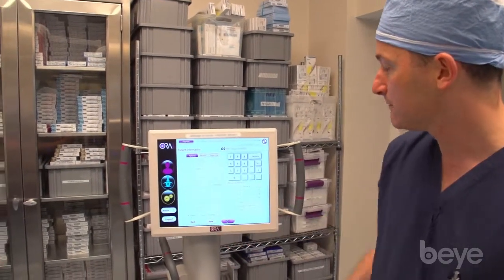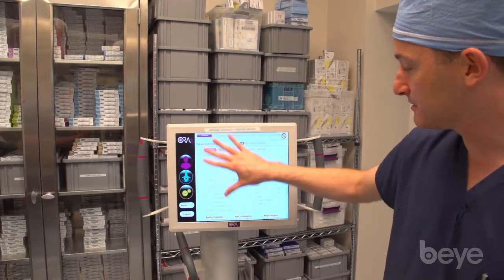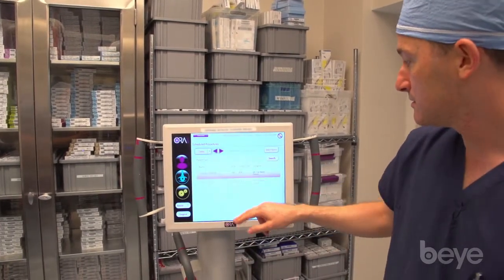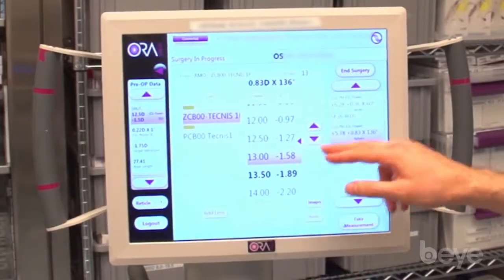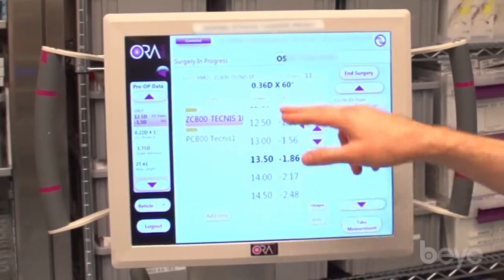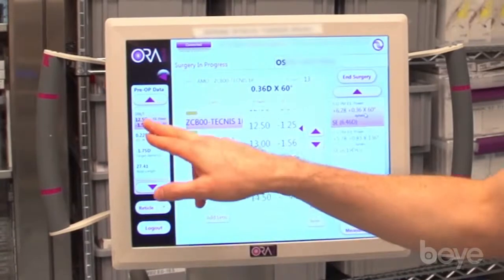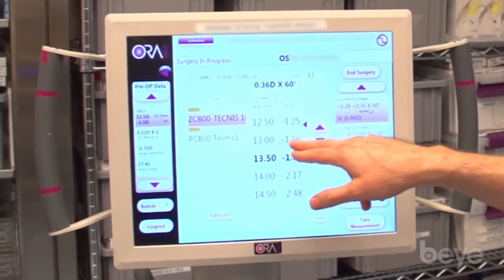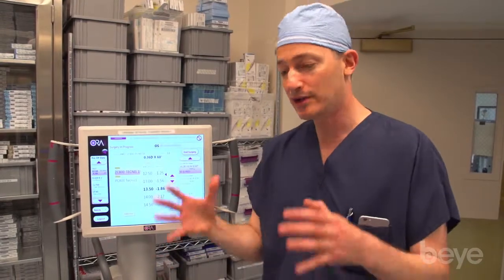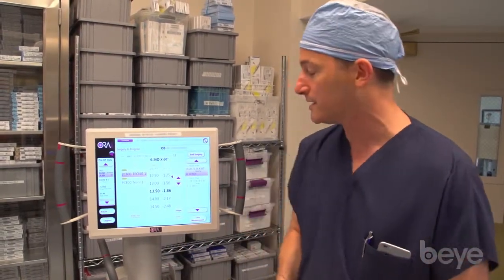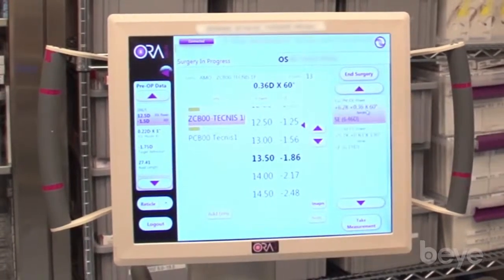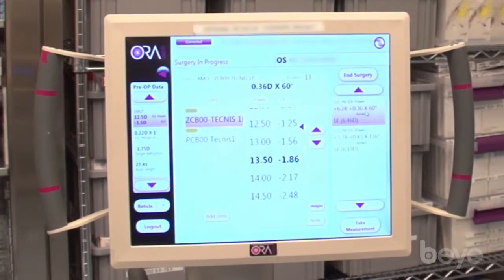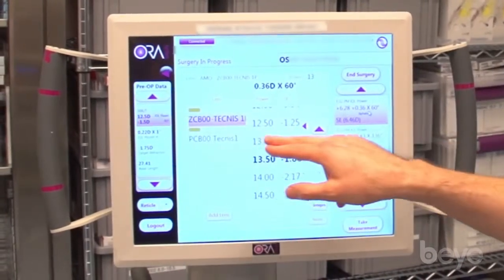We had two measurements — this was the first measurement and it told me the power lenses. I was going to place a 12.5 in this case for 1.5, but it told me to use a 13 to reach 1.75. This is something I see very commonly — I actually made an intraoperative adjustment to what I planned pre-operatively, and I find that my results are extremely tight around the desired spherical equivalent outcome. The astigmatism is down; we did arcuate incisions here. Based on this information I was able to switch from 12.5 to 13.